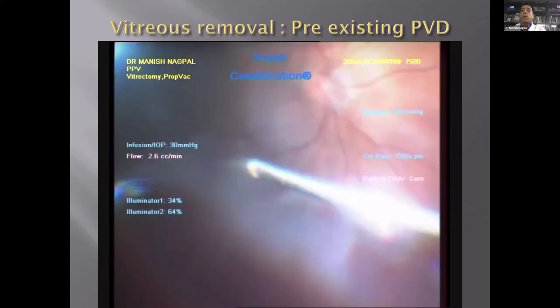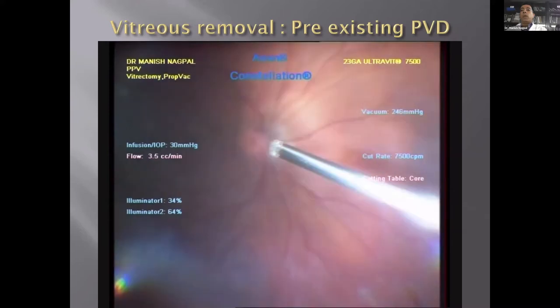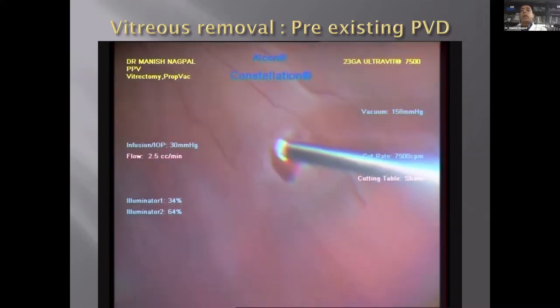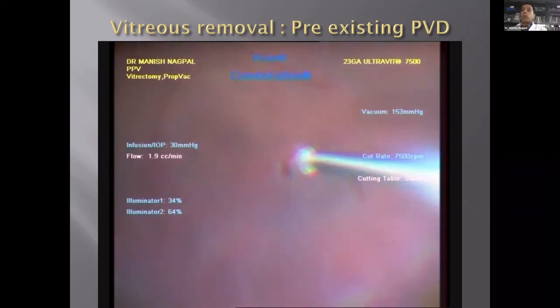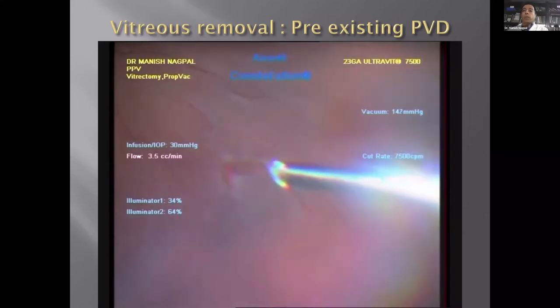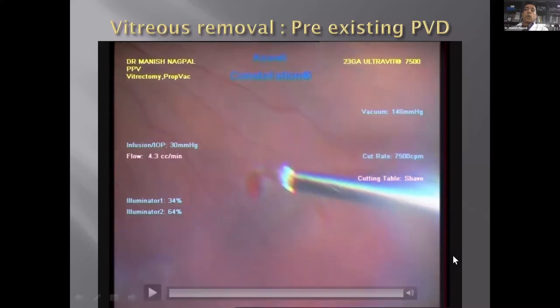This situation shows a pre-existing PVD, where the vitreous is detached — the hyaloid is already detached from the retina, making it much easier. All you have to do is go in and remove all the vitreous without having to create a PVD, then proceed to the next steps.